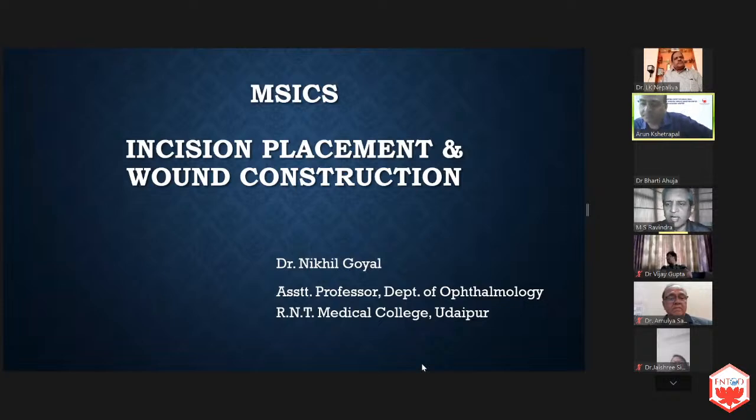See, the modern stereo coaxial illumination, Arun is an expert in microscopes, has made the surgery so easy. So the youngsters, if they want to buy a microscope, or even if people would like to change it, specifically ask for a stereo coaxial illuminated microscope, and all these corneal opacities literally disappear with that illumination.